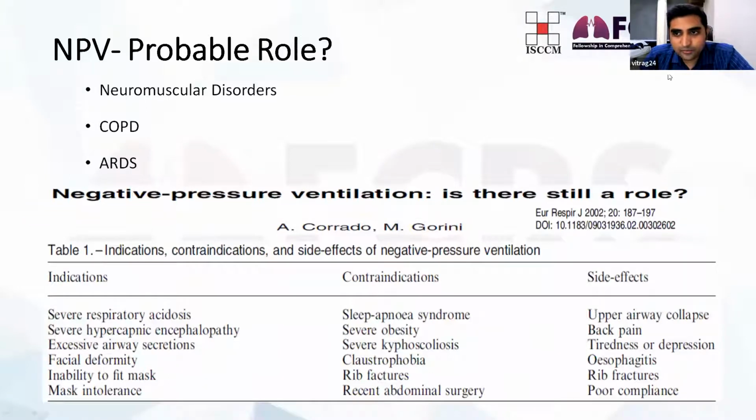So just a brief note about negative pressure ventilation. Is there any role of negative pressure ventilation? It is quite controversial. Some groups of doctors still support negative pressure ventilation, but there is not much evidence in comparison to positive pressure ventilators. But definitely it is more physiological, with better hemodynamics and less sedation.